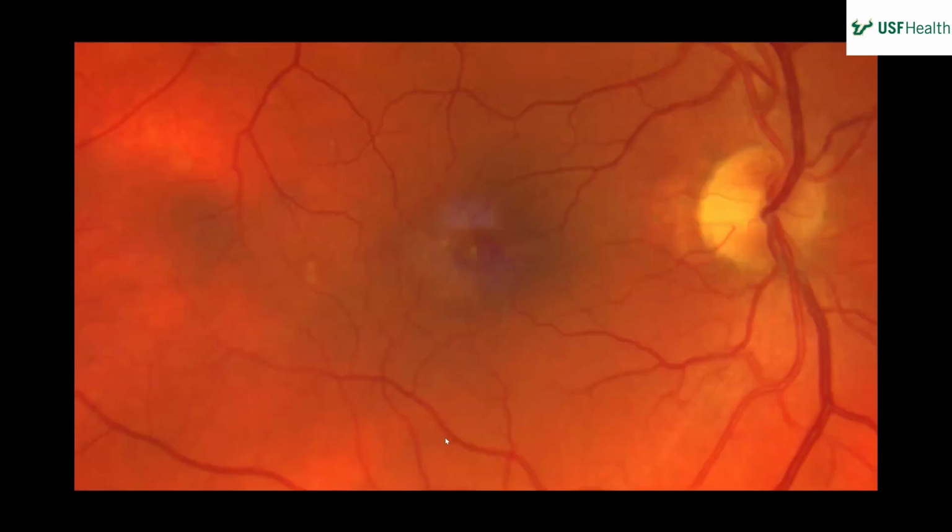And here we go. You have a color fundus photo of the right eye. The vitreous appears clear. The nerve appears like it has sharp borders. The vessels seem to be pretty within normal limits. Don't seem to be too attenuated or tortuous. And attention is drawn to the macula. There do seem to be some pigmentation around the fovea, so maybe areas of lighter pigmentation surrounding the central fovea as well.